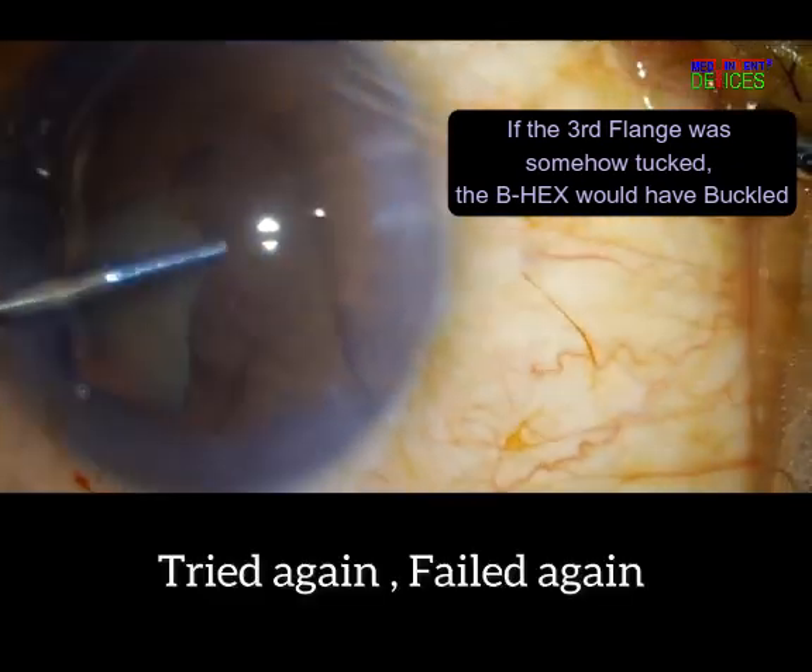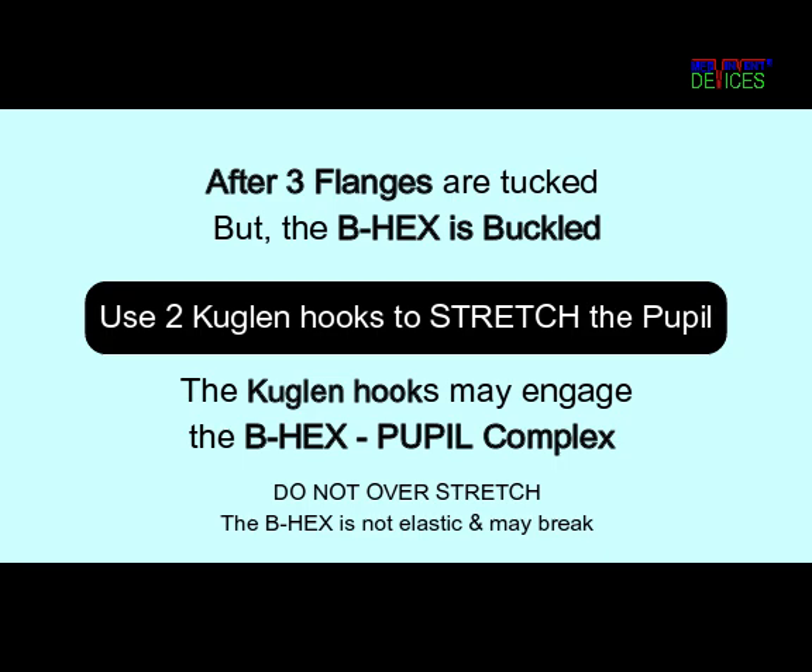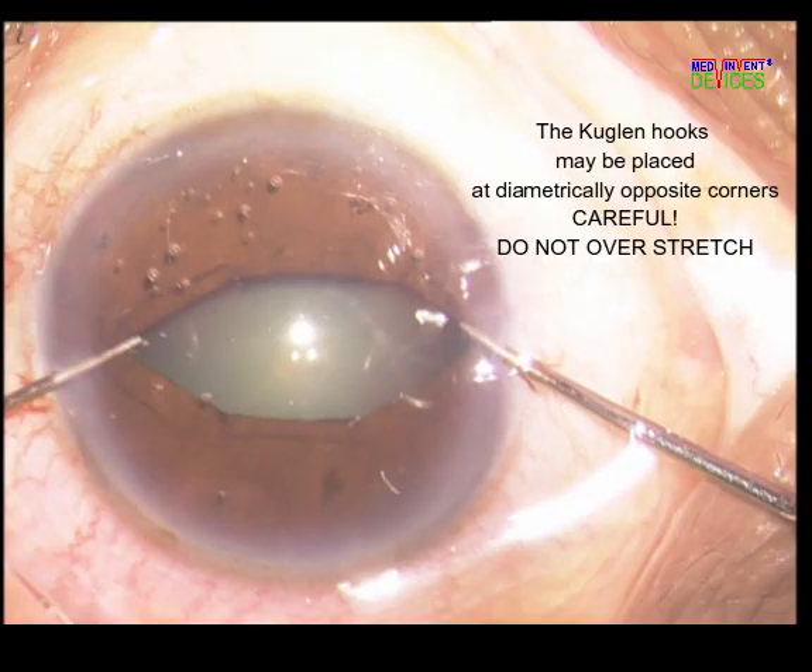Here, the third flange could not be engaged. But even if it had been forcefully engaged, the B-Hex would have buckled. The pupil may still be stretched even after all three flanges have been tucked. At this stage, it is advisable to place the Kuglen hooks at the corners. Overzealous stretching should be avoided as the B-Hex may break.